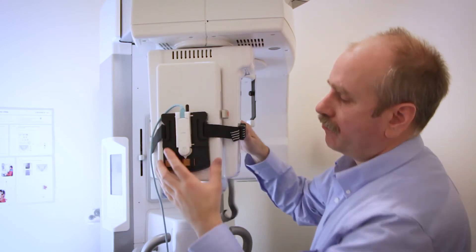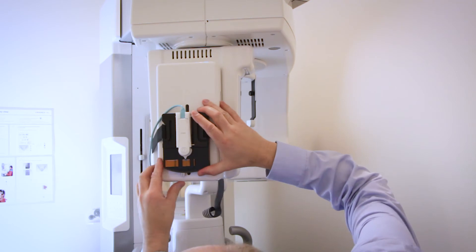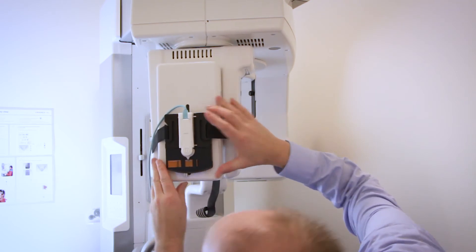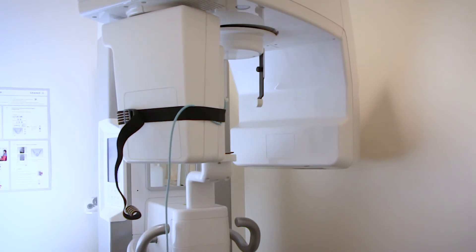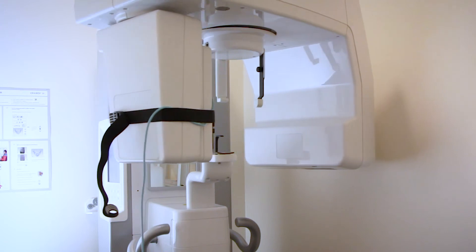Place it as centered on the image receptor and as vertical as you can. Place a radiochromic film in the holder and take an exposure. The goal now is to see where the radiation ends up on the film.